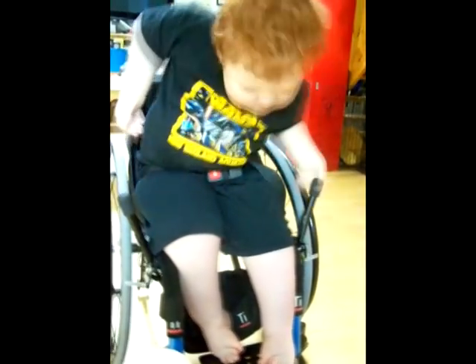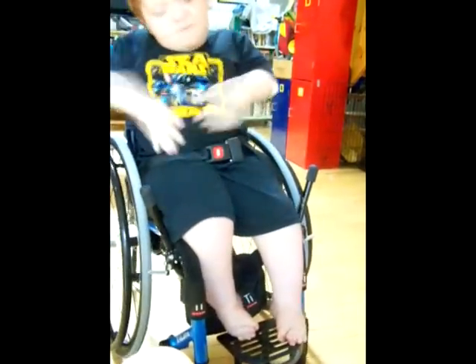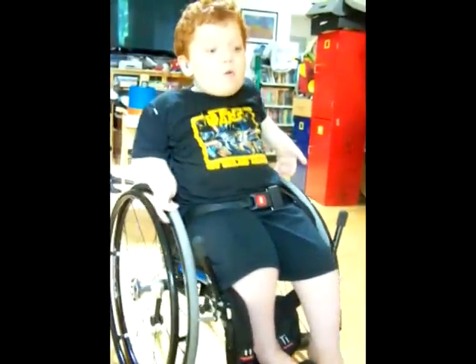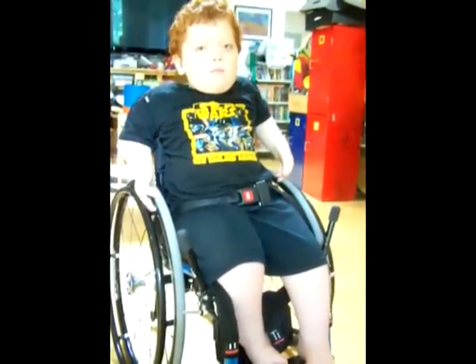Can you get them off again? With the brace off, they're not really that difficult without my brace. They're difficult without your brace? No, they're difficult with my brace. They're difficult with your brace. Can you show me how you turn all the way around, 360 degrees, full circle?